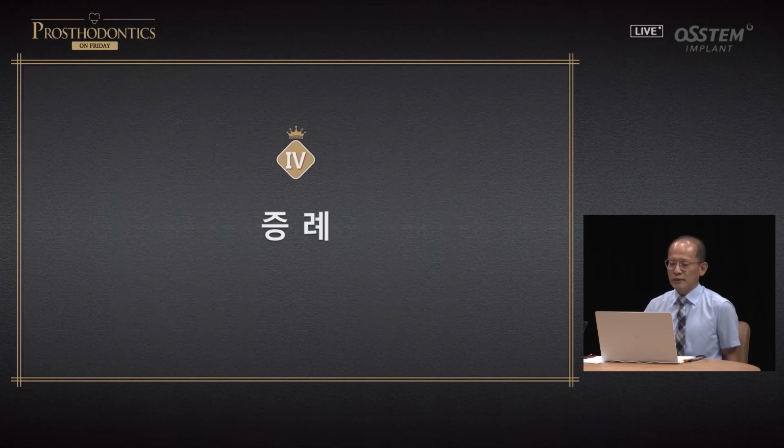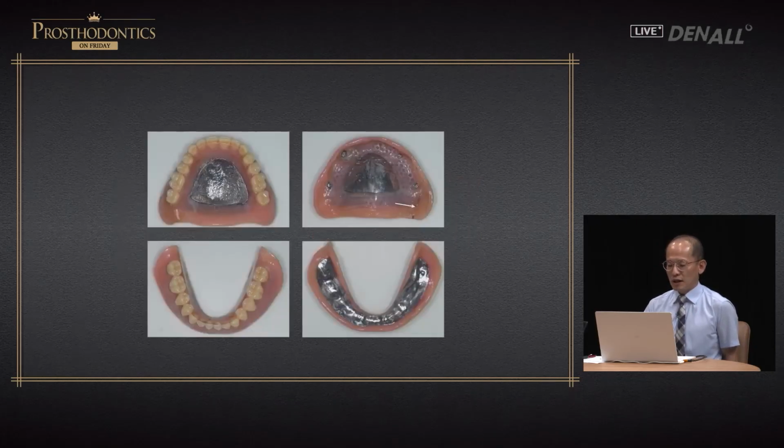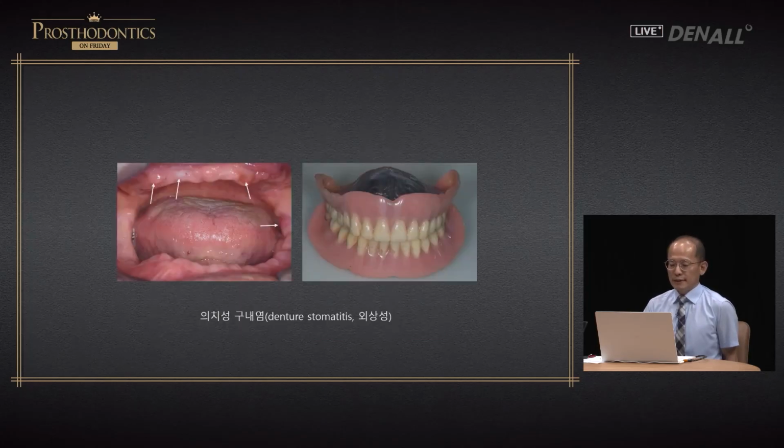Let's look at actual two cases. Now, for this patient, 11 years ago, I created the denture and he didn't come back to me again, but I also did his restoration, but there's a discoloration now and a bit of flexure inside. There's a fracture again, but interestingly, the occlusal plane did not wear that much.